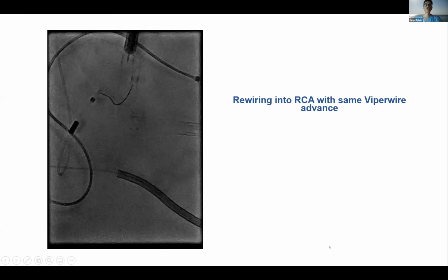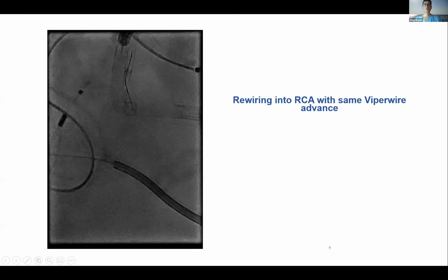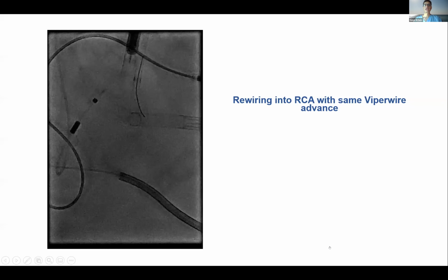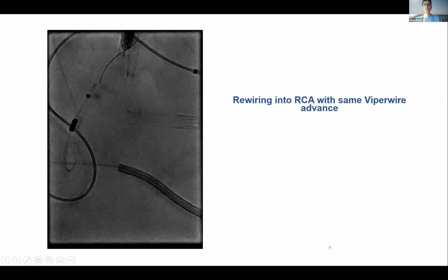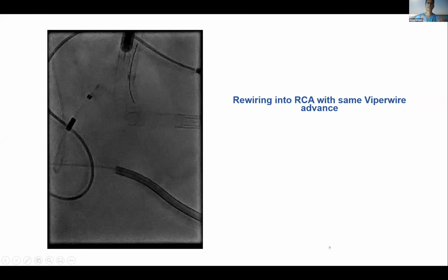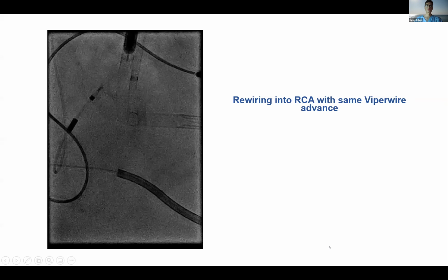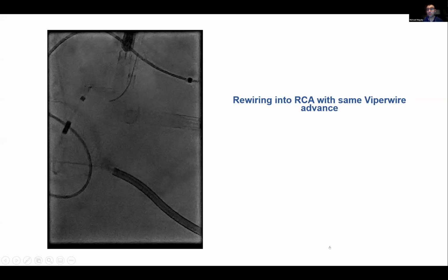Putting a guide extension. Some people sometimes here put a microcatheter over the side branch wire. Yeah. Some other people put a guide extension over this to try to exclude the side branch as much as possible. I don't know, any thoughts? Was that something of concern, or you thought that distance was enough that it was unlikely to have any issues there? We actually brainstormed all the ideas.